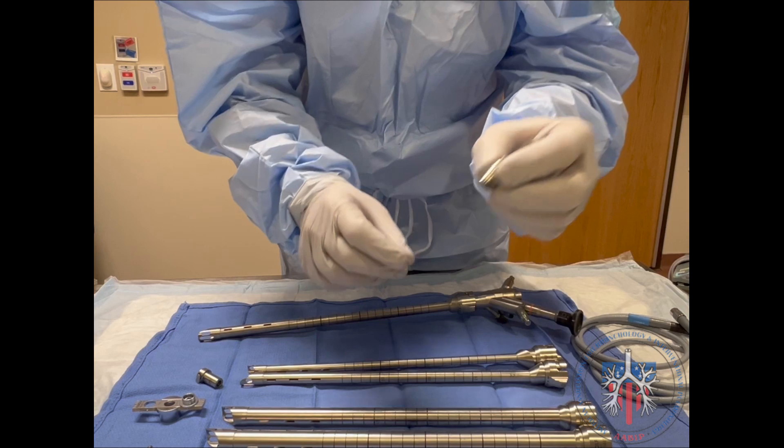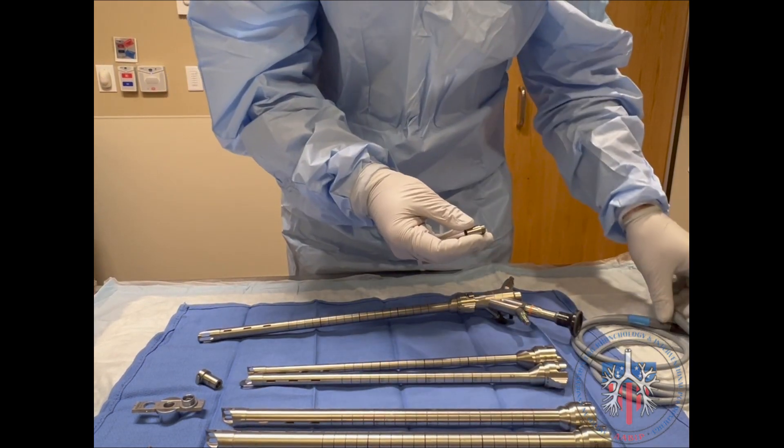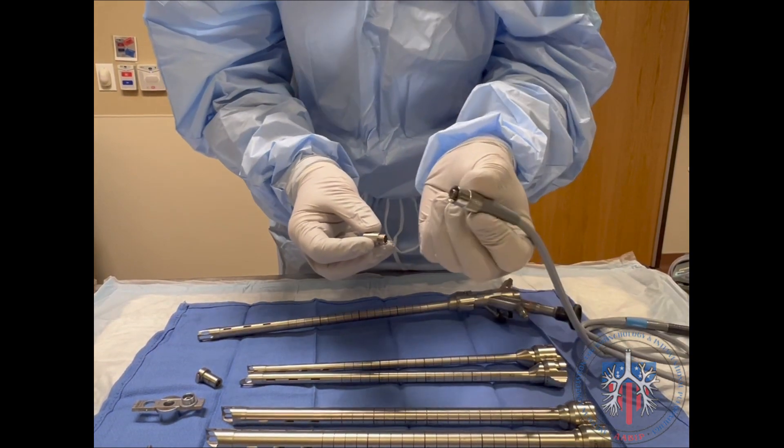The endoscope side adapter allows for connection of the Wolf scope to a Stortz light source.